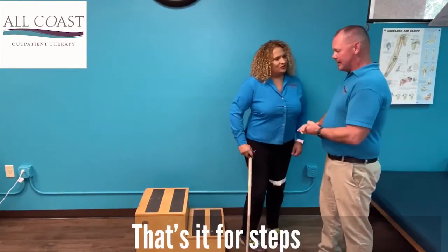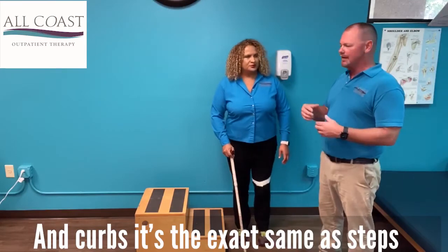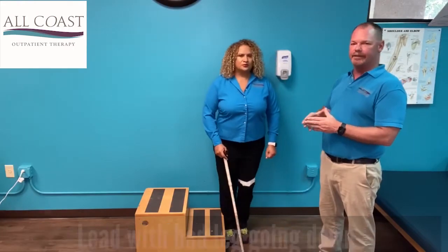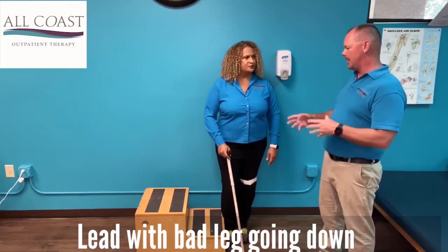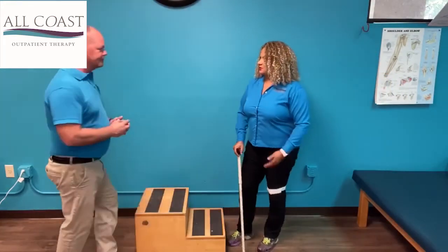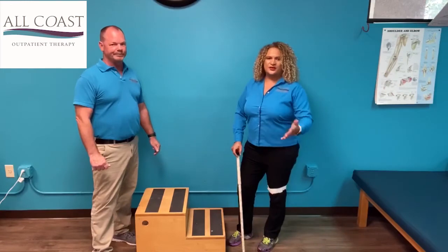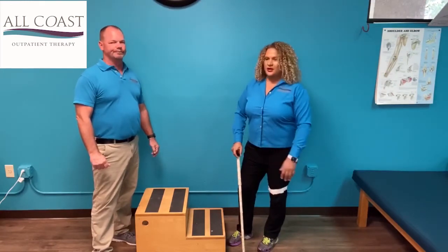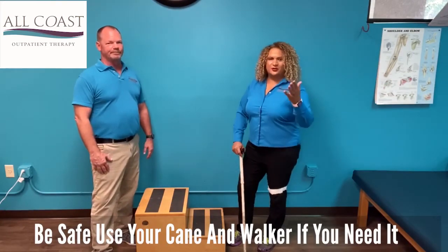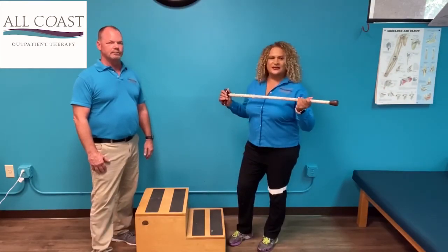That's it for steps. Curbs are a lot more common to come across, and it's the exact same thing as with the steps — you always want to lead with your good leg going up, lead with your bad leg going down, and keep the cane with your bad leg throughout. That covers using the cane on stairs, curbs, or any other surfaces you have to step up and step down. We're done with that until next week — always remember, be safe, use your cane and your walker if you need it, and we'll see you again next week. Thank you.